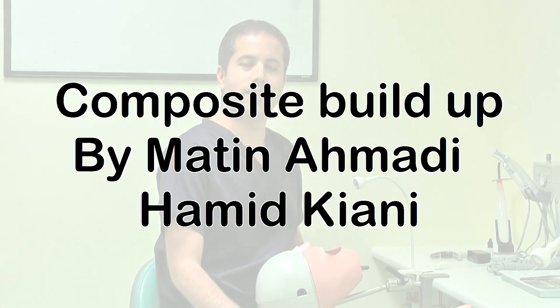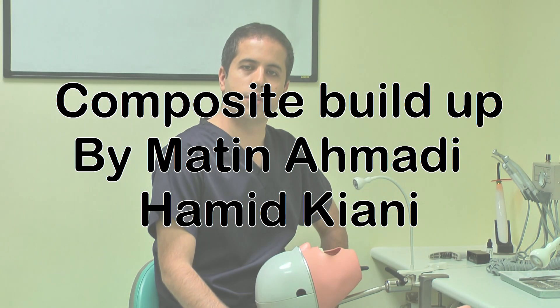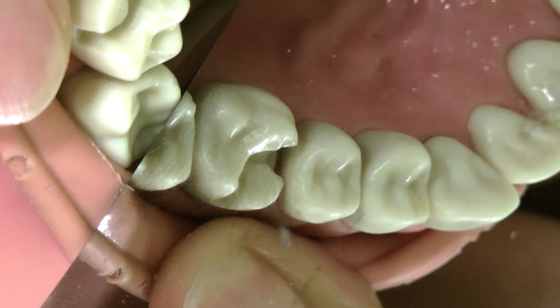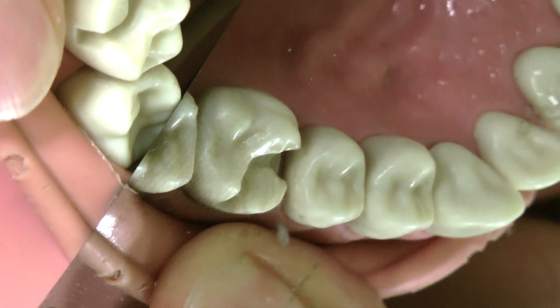Hi everyone, this is Matin. This is our second video on posterior composite buildup, as you voted for on the poll on our page Matin Dental Course. This is how the tooth has been prepared in the last few sessions.